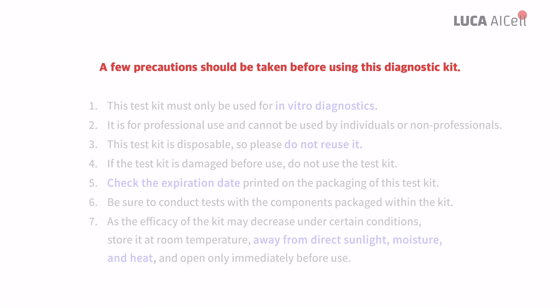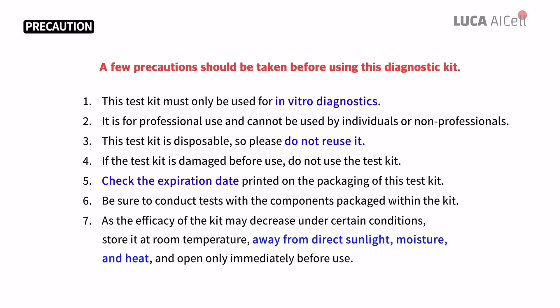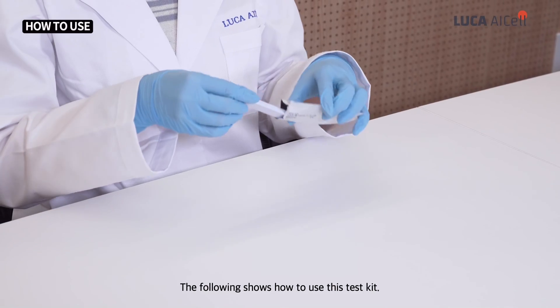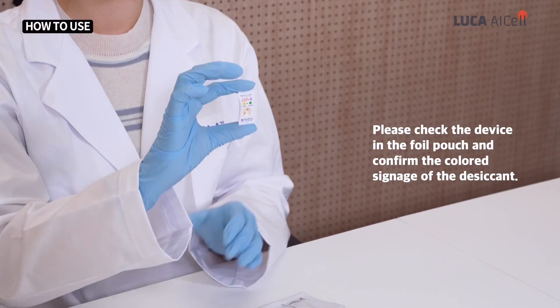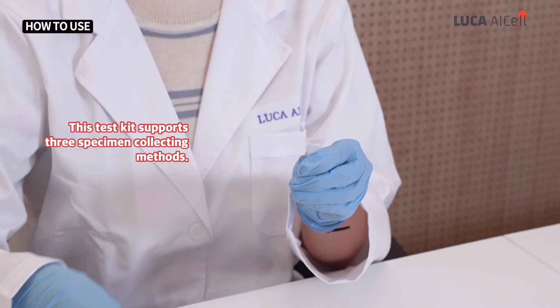A few precautions should be taken before using this diagnostic kit. The following shows how to use this test kit. Please check the device in the foil pouch and confirm the colored signage of the desiccant. This test kit supports three specimen collecting methods.